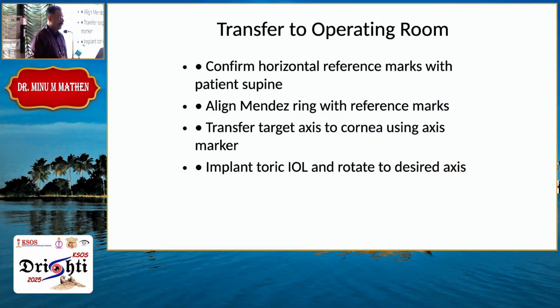And then transfer confirm. The point is it should be dry and not to make them blink or tear too much, because otherwise before it dries up, if they blink and then it will go off, patient will come to theatre, lie down outside the theatre, inside the theatre they'll block, and then massage, and in the end nothing will be seen. Finally the anesthetist will come and say I don't see the dot very clearly, shall I let it go down, he will ask after blocking.